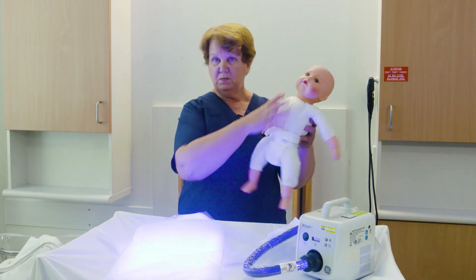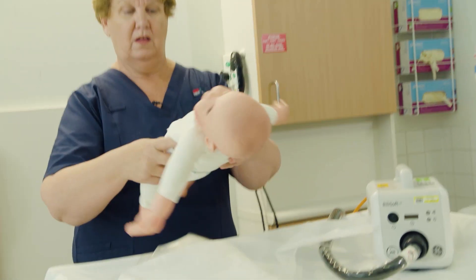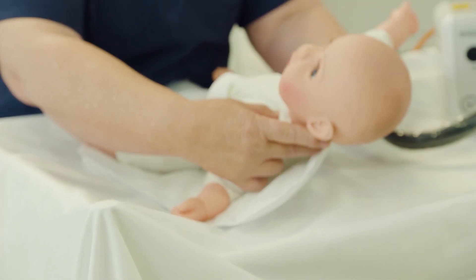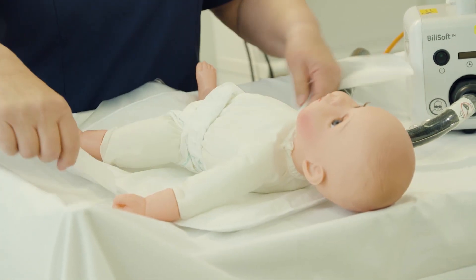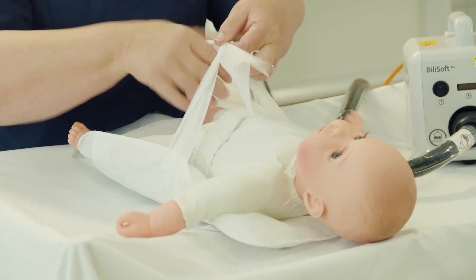Your baby should be completely naked except for a nappy. The baby is placed on the BillySoft to the nape of the neck, the top of the shoulders, and then it is firmly tied around your baby.